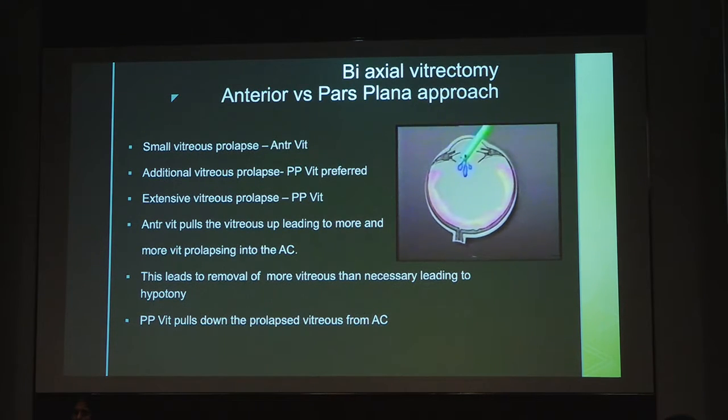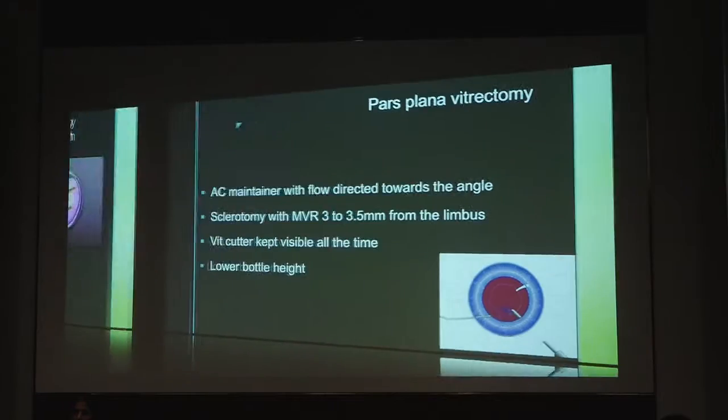So through the pars plana vitrectomy, in case you have a very large PC tear, and if you're not very good at doing a posterior pars plana vitrectomy, you can take the help of a senior surgeon, or do as much wound toileting as possible, and then refer to a senior surgeon.